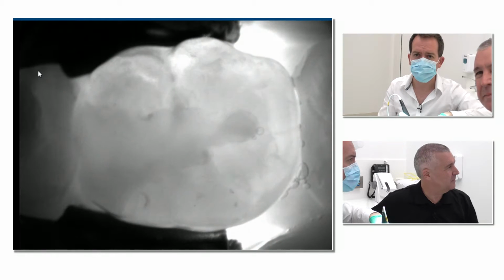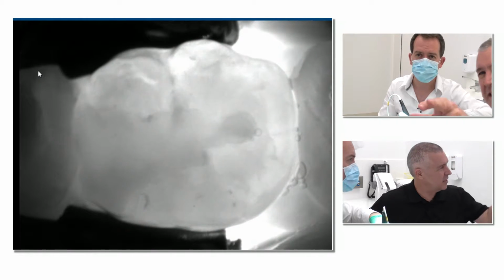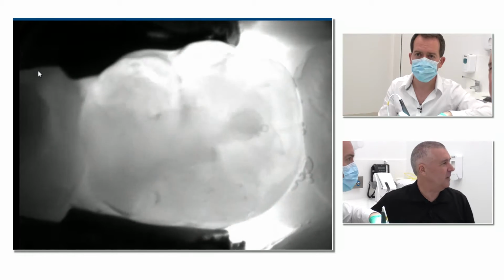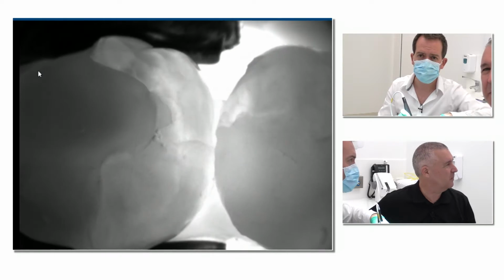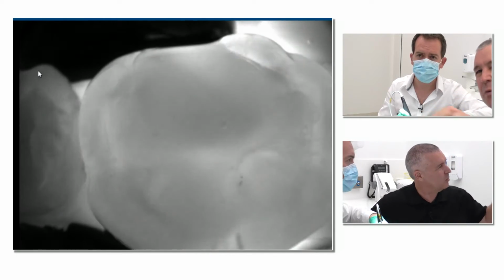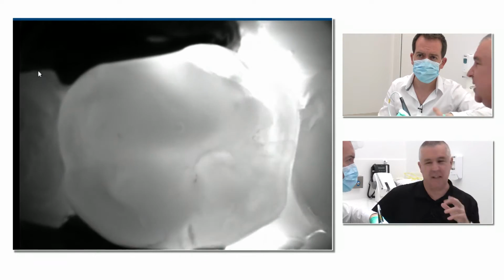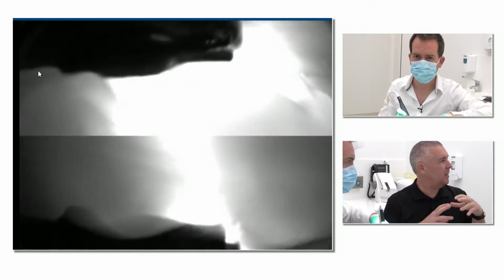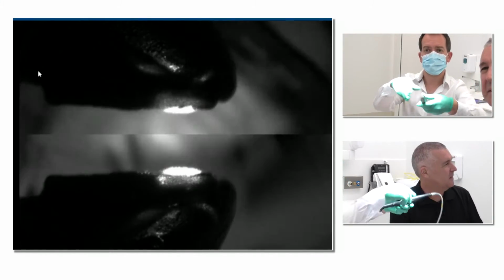So if that composite were leaking, for example, would we expect to see some darkness at the margins? You would. There's actually one spot there, a little bit of darkness on the margin. It's just a really nice way of spotting really well done composites. And you can also see around the margins quite clearly in this view. There's an interesting discussion point about why some composites look different, and that's obviously because of the way the light is scattering around, whether they're nanofilled, microfilled, or hybrids. In fact, even how well polymerized they are can affect that as well. Interesting. That obviously affects the way that the microparticles are distributed.